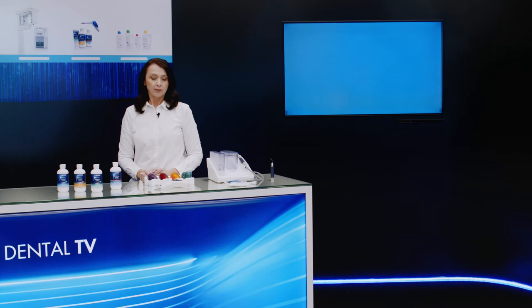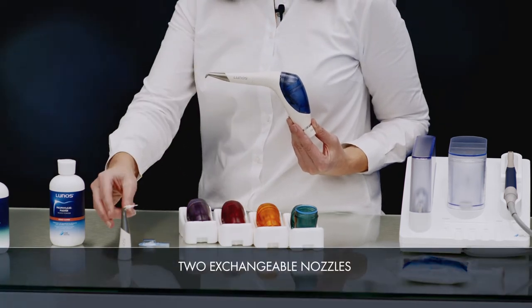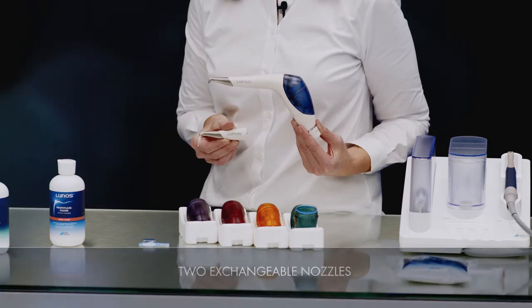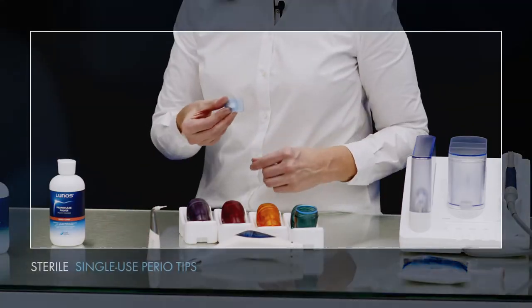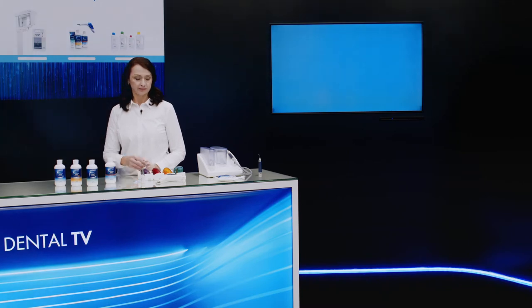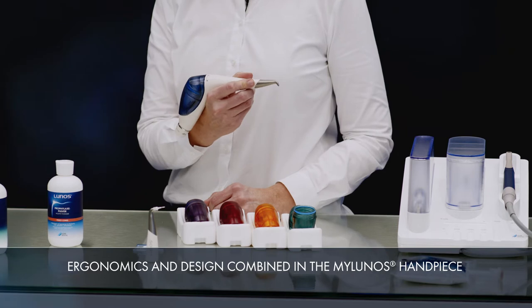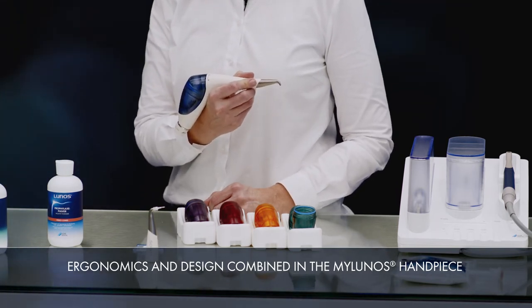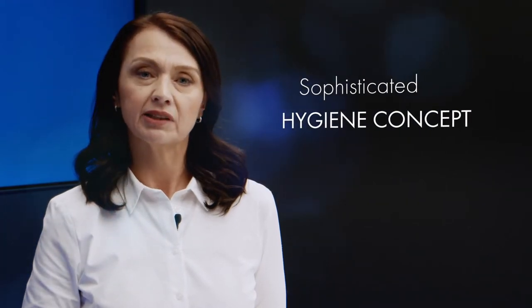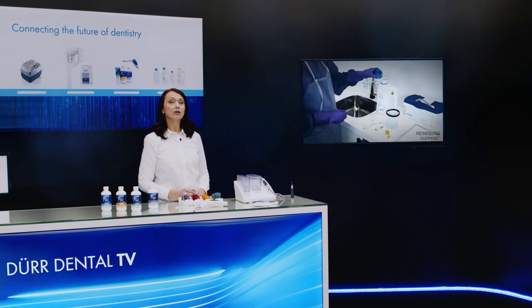The myLunos Prophy powder jet unit consists of a handpiece body, two exchangeable nozzles for subgingival and supragingival treatment, and two exchangeable powder containers in a range of colours. The mobile powder jet unit features outstanding ergonomics. The powder chamber is positioned in the middle of the handpiece, making the unit perfectly balanced. This makes it possible to work fatigue-free and ergonomically. The myLunos powder jet unit also incorporates a sophisticated complete hygiene concept. The unit can be completely disassembled and all the components are suitable for either manual or automated reprocessing.